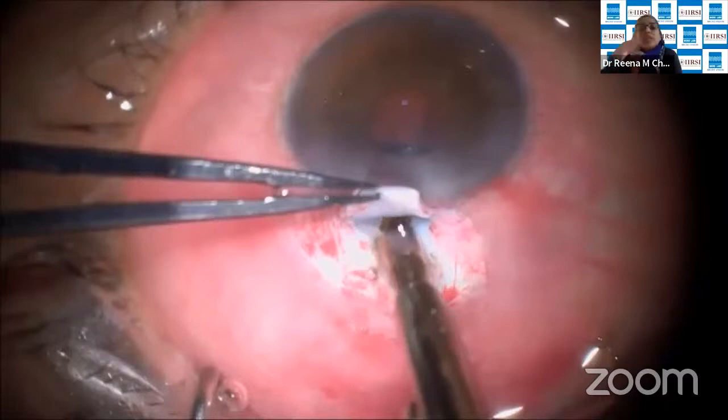If you went up prematurely, then you'll end up making the ostium on the sclera-ciliary body area. So it should be anterior to the scleral spur. Exactly, between CLJ and SLJ, the corneolimbal junction and sclerolimbal junction. It should be in between that, and this area is exactly 1 millimeter broad. So when we take a 0.75 punch and take 2 punches, we are cutting exactly that much area. Going posterior can also make a cyclodialysis cleft. Exactly. I've seen one patient with a cleft who would just not respond to anything till UBM showed that cleft right at the posterior lip of the trabeculectomy inner ostium.